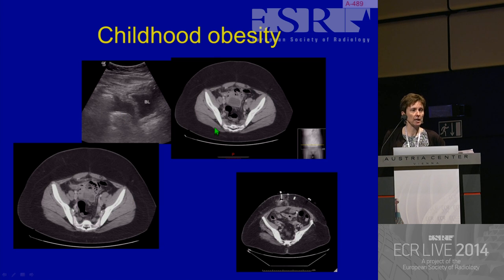Of course, when you CT in that scenario, you also have to increase your imaging parameters. So it's not a low-dose CT because we needed the increased dose to actually get penetration to see. And here you can see his appendicolith. There's his dilated appendix, and here are his complex loculated pelvic abscesses. So this was a case of perforated appendix, and even my experienced pediatric surgeons that I work with couldn't palpate deeply in this child's abdomen due to his girth, and I think that's a problem that we're all going to have to deal with. Certainly try ultrasound, but you may not get your answers.